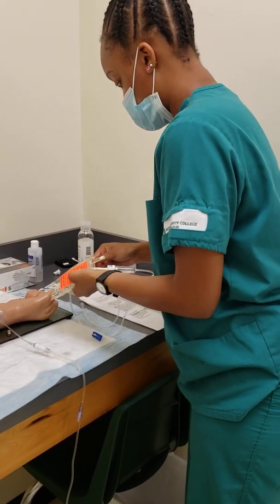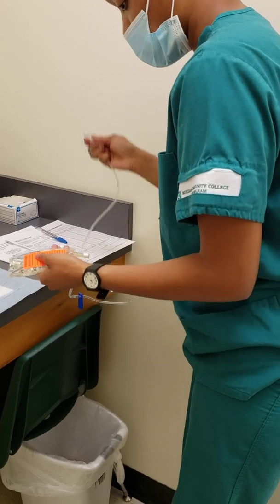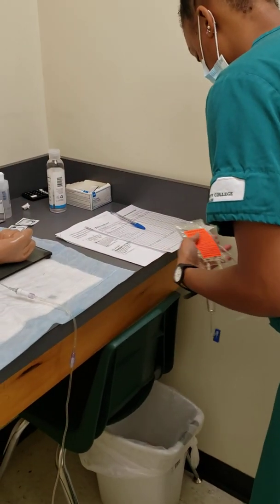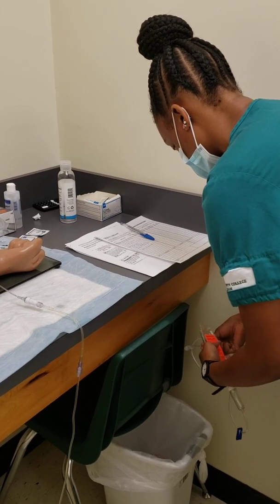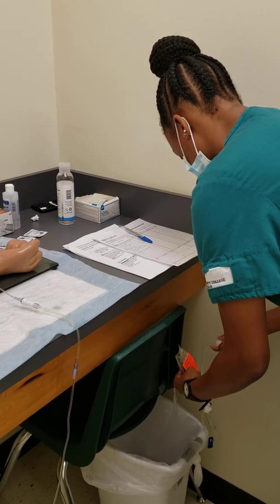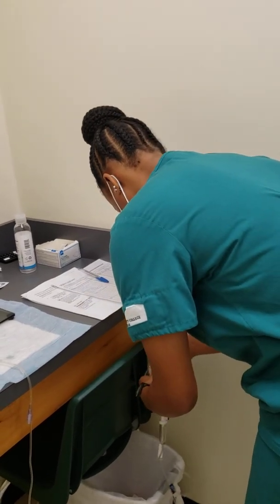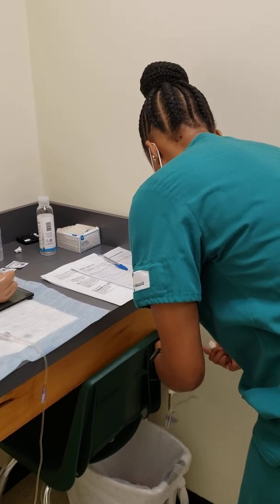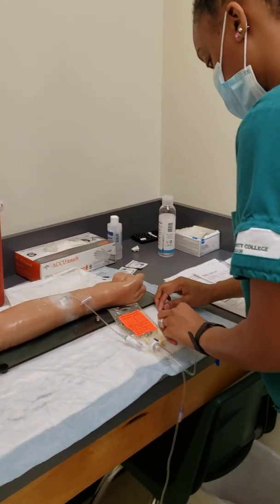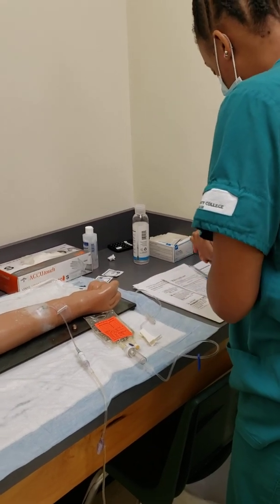Okay, and we're going to remove this cap and make sure it does not touch anything, because if it does, the port is considered contaminated since it's already taken off. But we're going to check to see if it's patent. Okay. All right. My line is patent. Okay. All right. So now I'm ready to go in my patient's room.